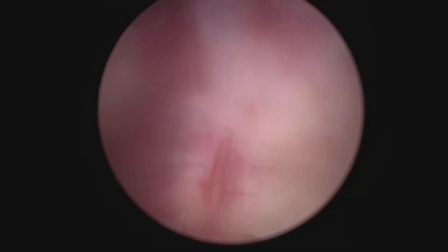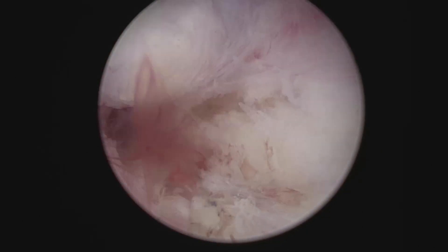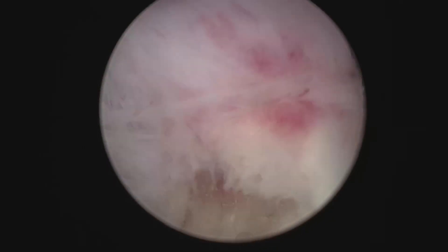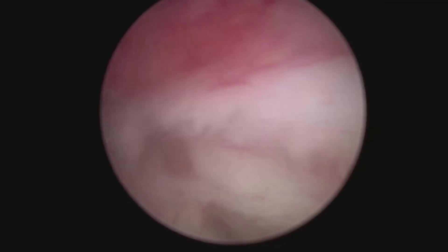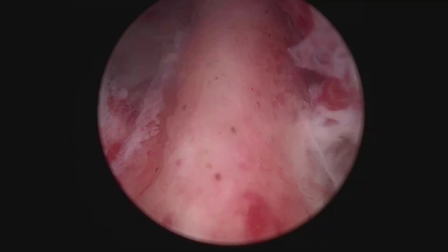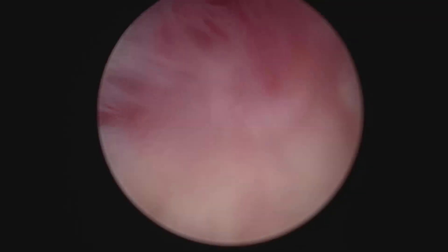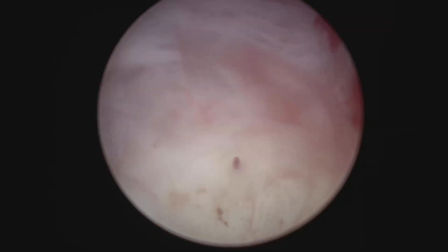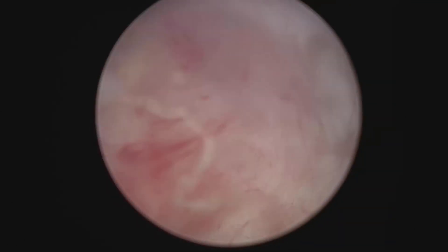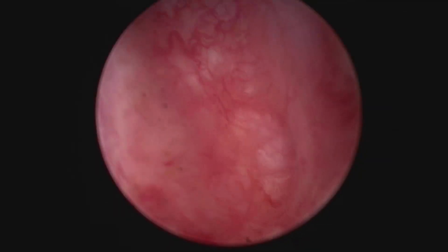Initially, we're going to make the lower parts liberation. I'm going to cut — you see this attachment of the apex to the sphincter in the lower part — trying to get up, let's say to three o'clock, because we will do the liberation of the lower parts initially. I don't want to break the sphincter here; it's quite liberated already. Now I'm going to enter mechanically into the plane of the apex. I found this very fast and very convenient. That's how I enter the plane between the adenoma and the surgical capsule.